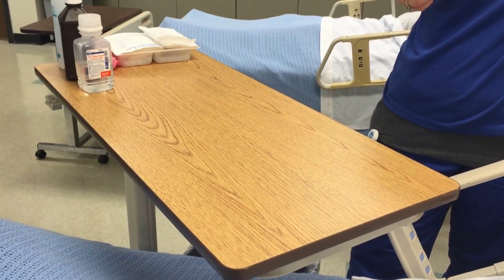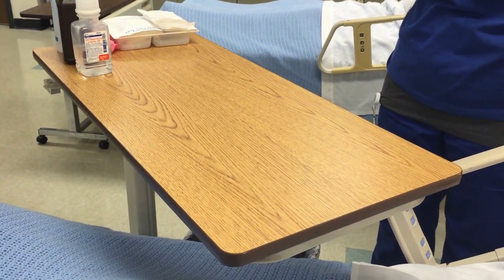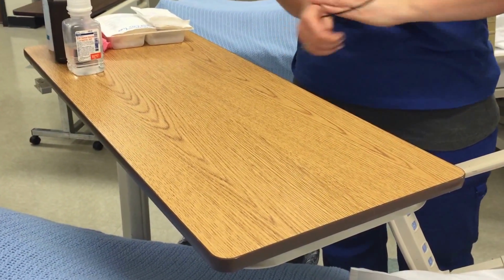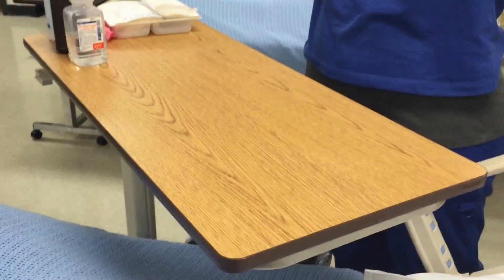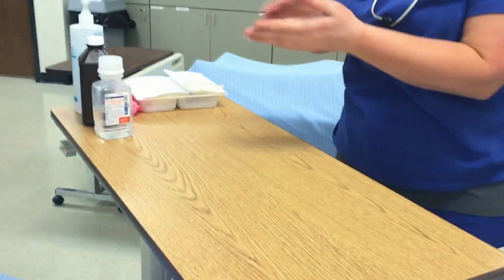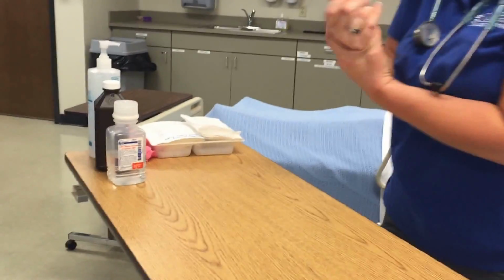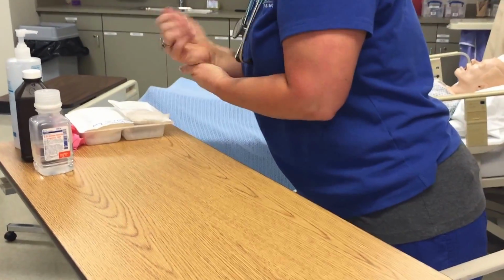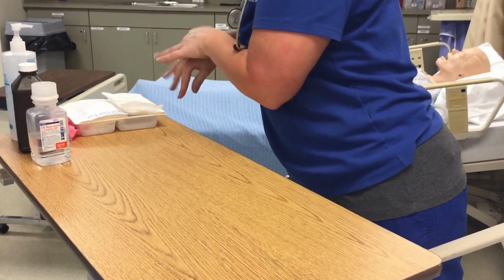I know initially when I had come in here, my hair was up, but it had come down. So, it had fallen out. Definitely want to make sure that with your patients, you want to make sure your hair is back as far as possible. That stuff can get into the trach. All right. Hand hygiene again.